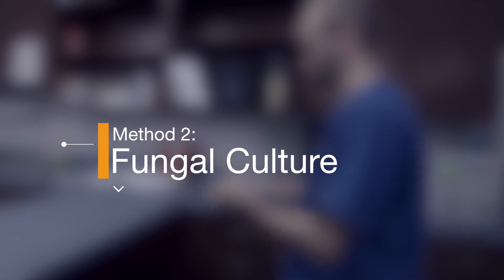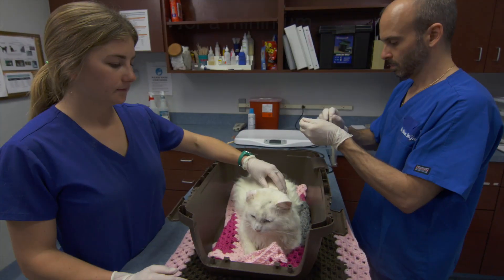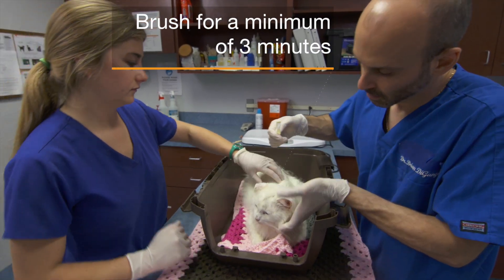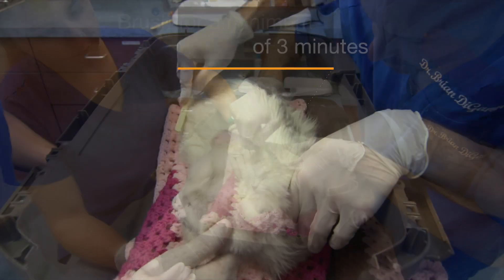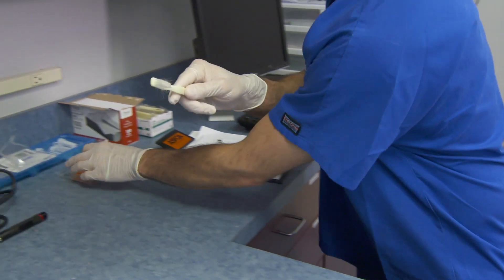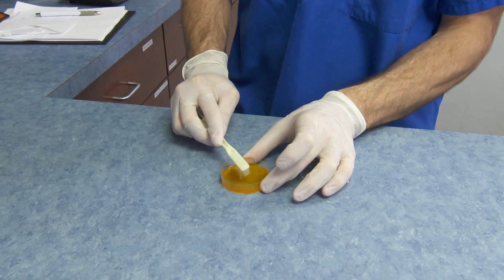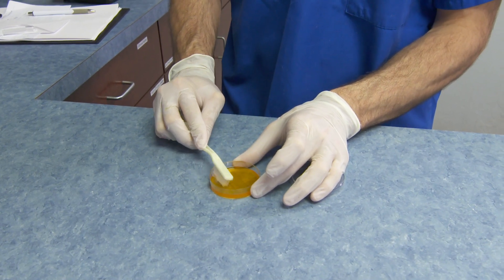Method 2: Perform fungal cultures. Before treatment has begun, use a new toothbrush and vigorously brush the animal's entire body for a minimum of 3 minutes. Brush any areas with skin lesions last so as to minimize contamination of the rest of the coat. When complete, gently push the toothbrush bristles into a fungal culture plate, starting in the center and working outward, to cover the entire surface of the plate.